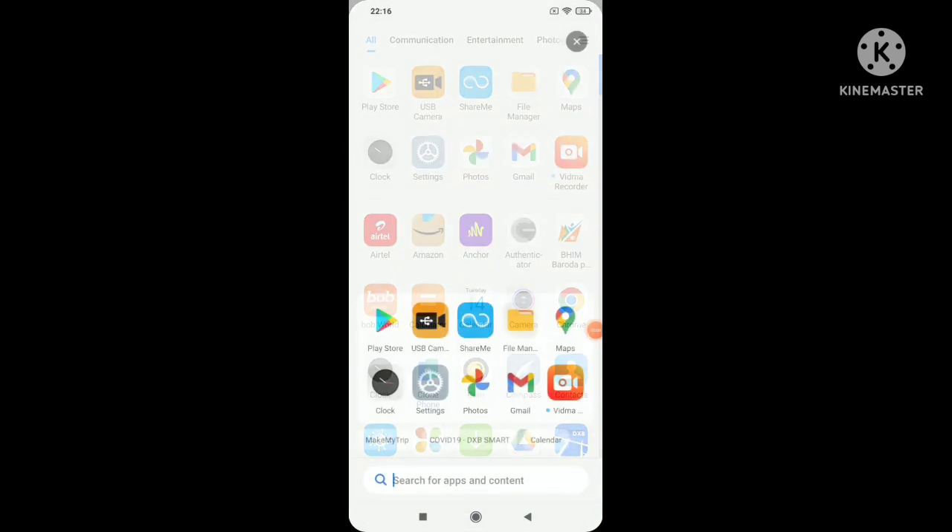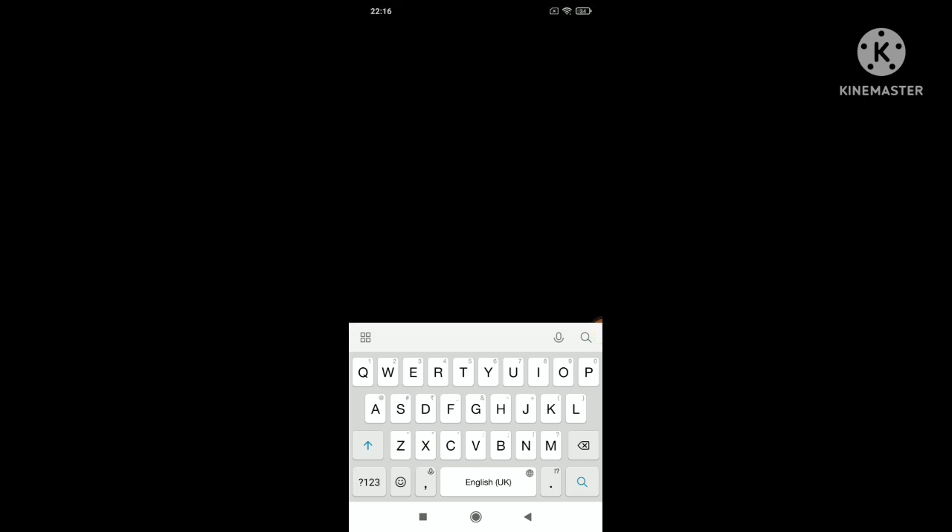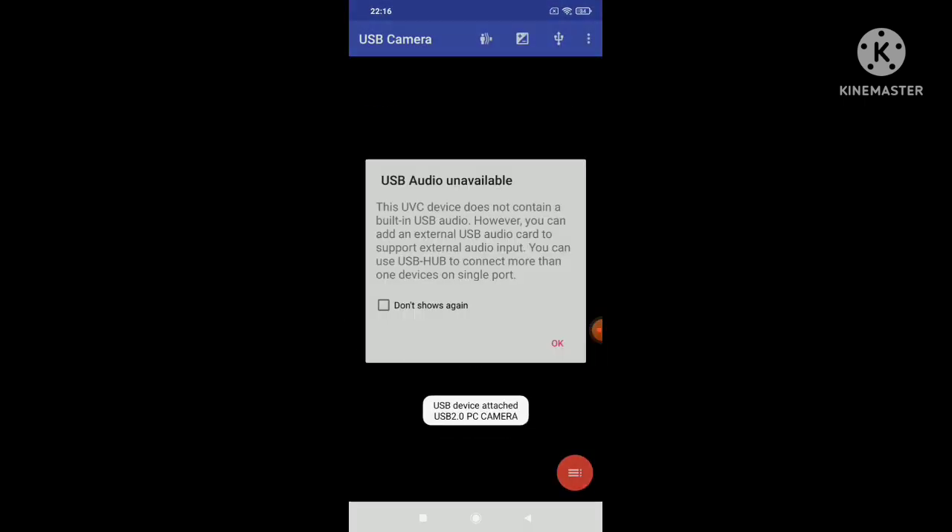To make the camera functional, a USB camera app needs to be downloaded from the Play Store. When the camera is connected to the mobile and the app is opened, it will automatically open up the display through the camera. The LED light is pretty bright, as you can see, and so is the quality of the camera video.